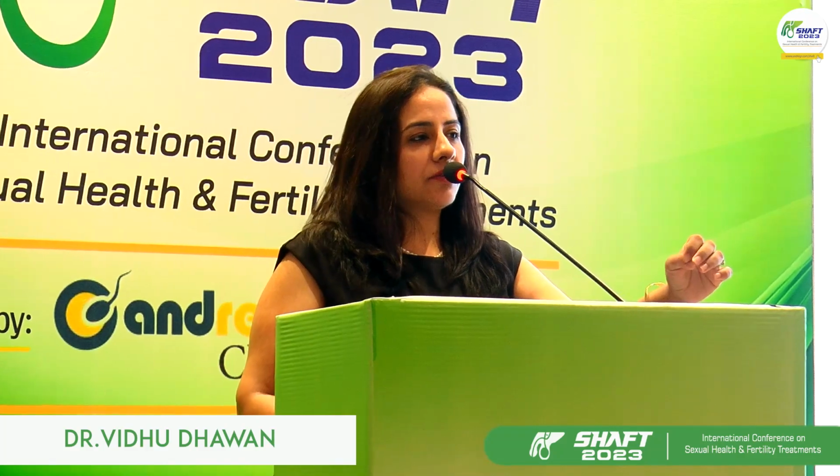So I will be touching base on a few more studies as well. But what do we do when we have high ROS levels? Are we routinely doing the analysis of the ROS levels? No. Though at AIMS we do routinely perform ROS testing for patients with infertility, recurrent miscarriage and IVF failures, etc.